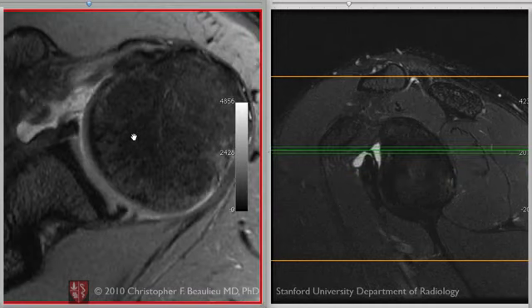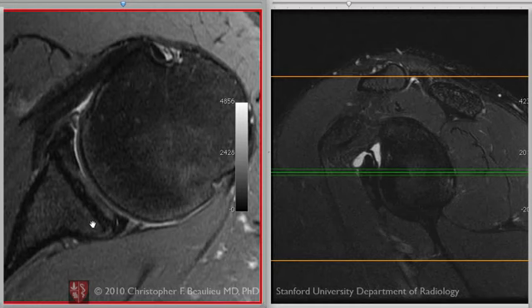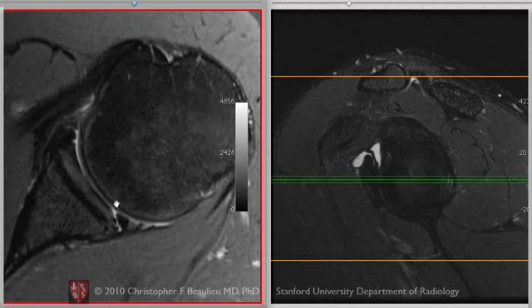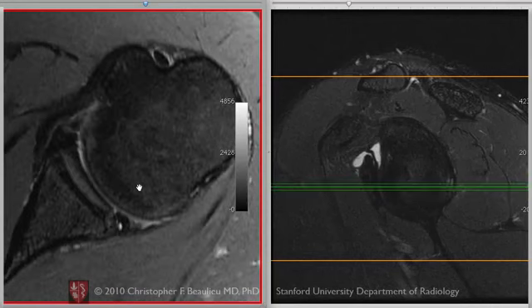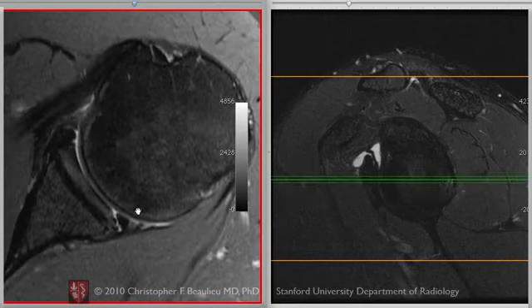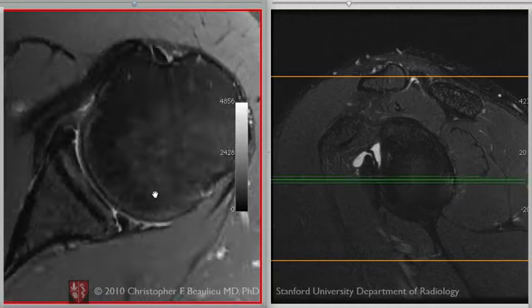Contrast that with the posterior labrum. Here we are in the mid glenohumeral joint, articular cartilage. Here's the posterior labrum, and on one or two sections we see very bright signal intensity coursing through the labrum, through the base of the labrum, back towards the edge. And that's on several adjacent cuts. So the labrum triangular itself is relatively intact, but this structure is detached at this point.